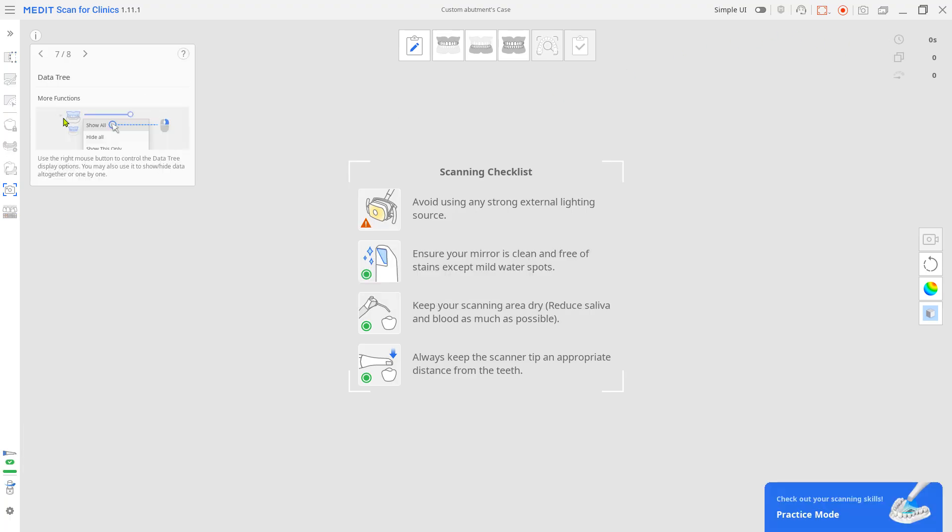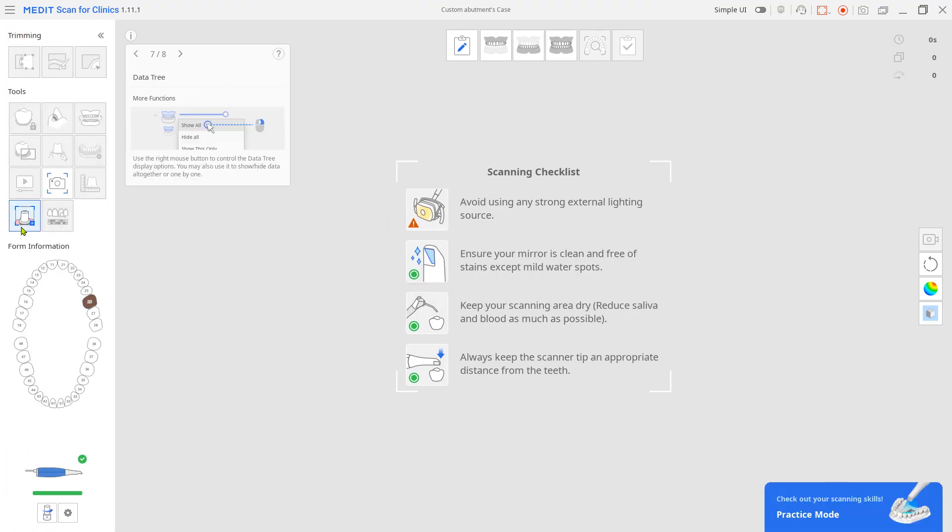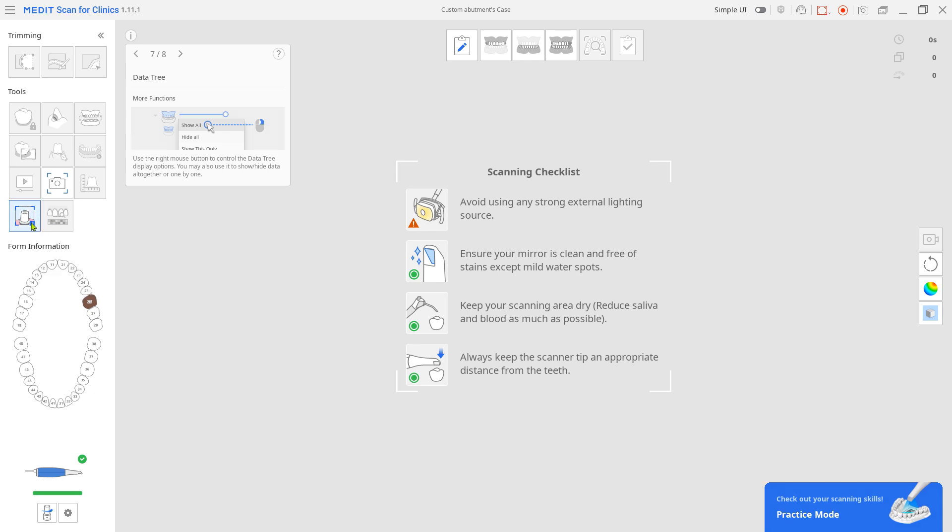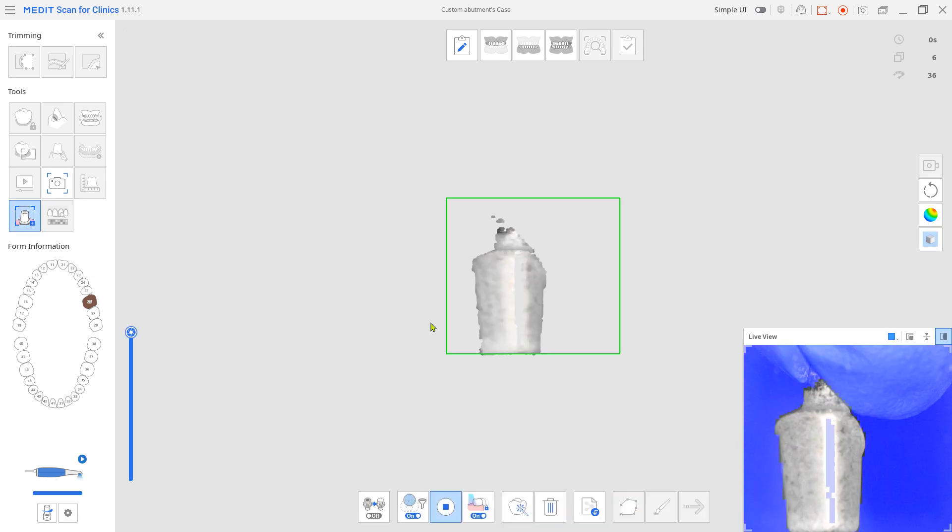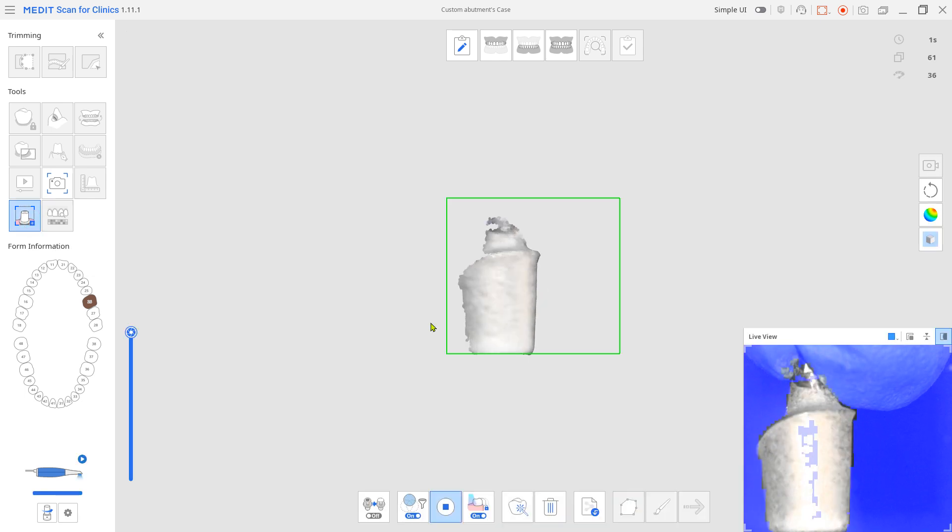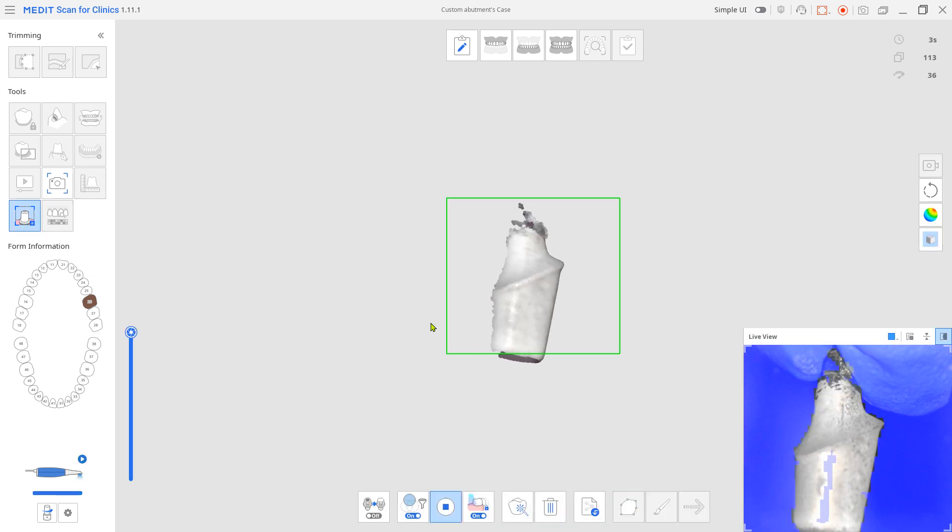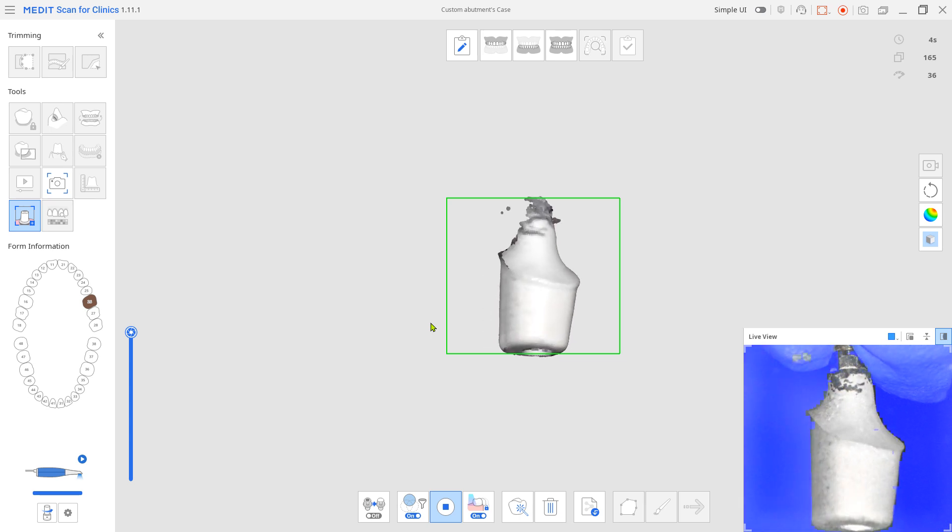First, we are going to register the custom abutment. Click Register abutments from the left. Note, if the abutment is too glossy, then apply some scan spray over it before scanning. Wearing a latex glove, hold the very bottom connection area of the abutment and scan from the side to the top.